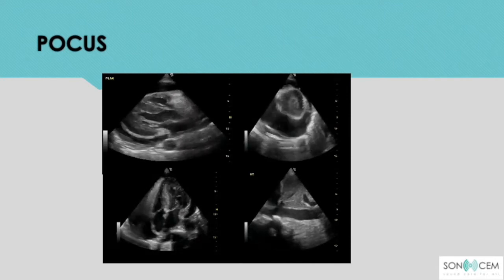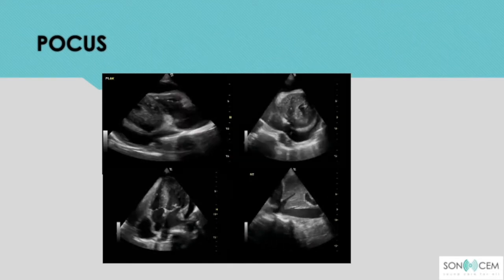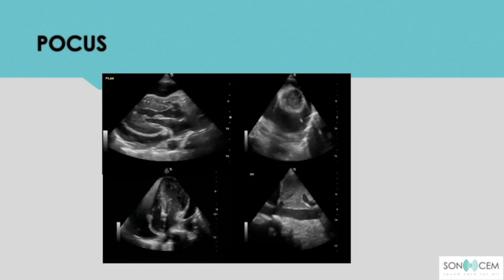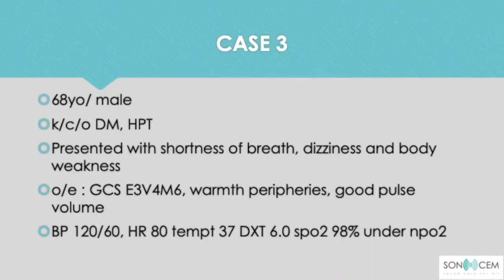And the last clip, the IVC, is plethoric, distended. So, what's in your mind? Cardiac tamponade. Okay. We move to the next case.